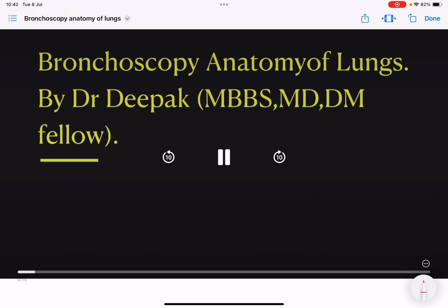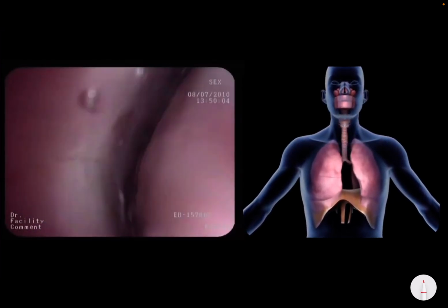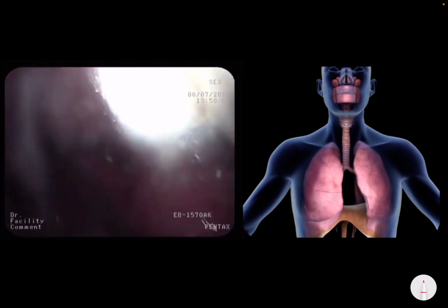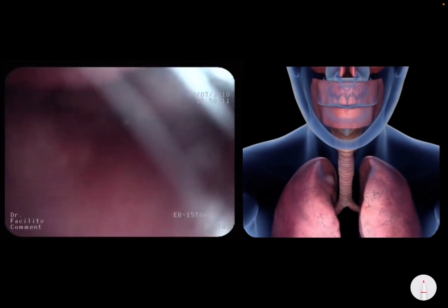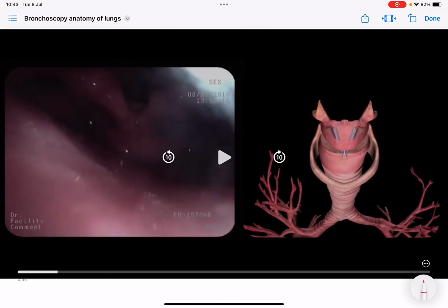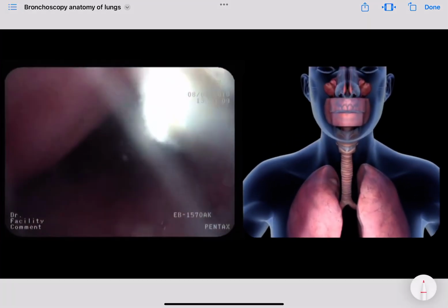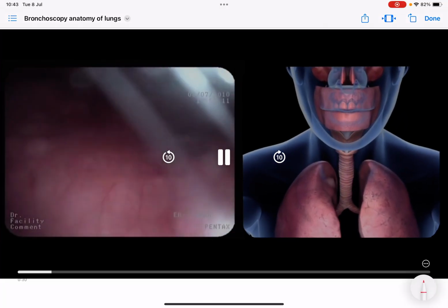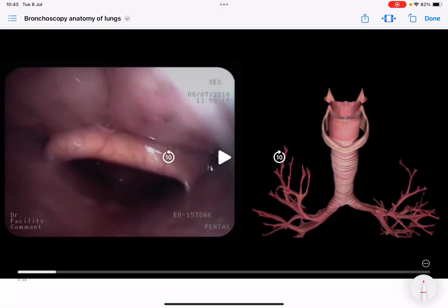In this video we mainly enter from the nasal cavity side. This is the nasal cavity, and when we exit through the posterior nares, the first structure visible is the epiglottis. Remember, the epiglottis is a leaf-like structure. This one is the epiglottis.